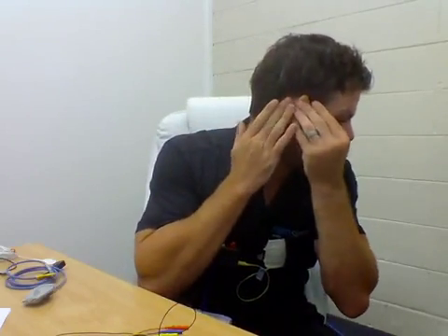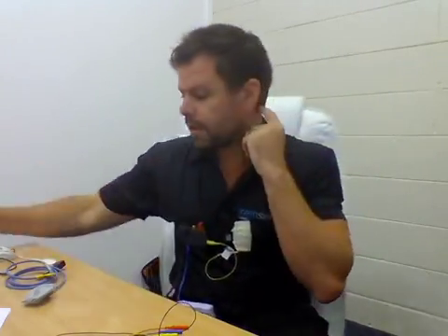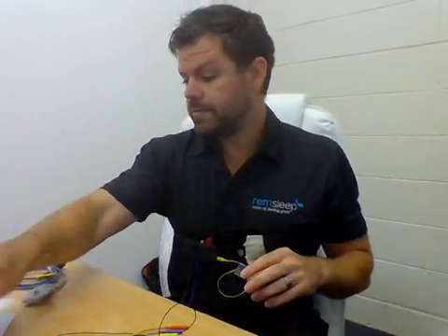The next one is the red cable, and that goes behind the right ear. So on this bony part behind the right ear, we peel off and stick on the back there. And then the last two, the blue and the orange, are our ECG leads. We get the blue one, and that just goes down on the bottom left rib. Okay. And then the orange one just below the right collarbone. Alright, so just feel the bone, just down from there. And then that's all the electrode wires.